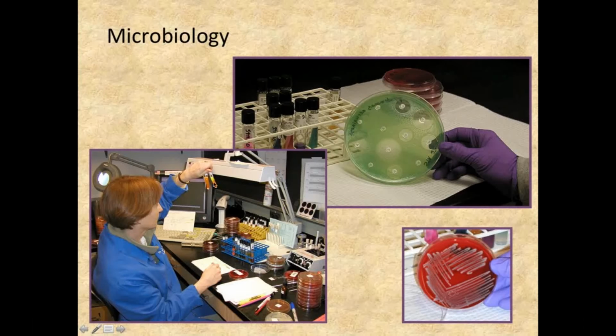And they're first plated on a Petri dish containing a rich agar mixture here. This agar has blood in it, so it looks bright red, and we very cleverly call it blood agar. And it's a general culture medium that we will use to grow the initial bacteria, and then we'll identify the bacteria using various biochemical tests that change color. And this medical scientist is looking at some of those tests, looking at the color changes in the tubes to determine what this bacteria is and what infection might be happening in the patient.